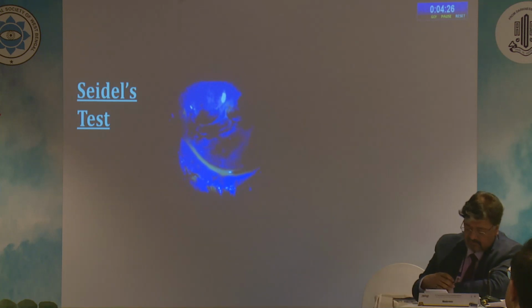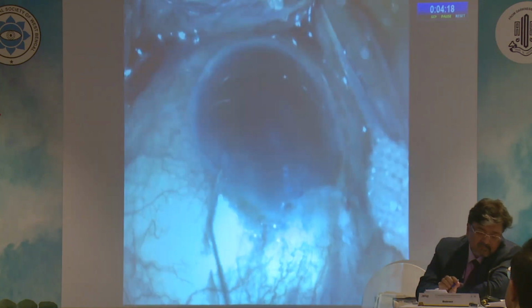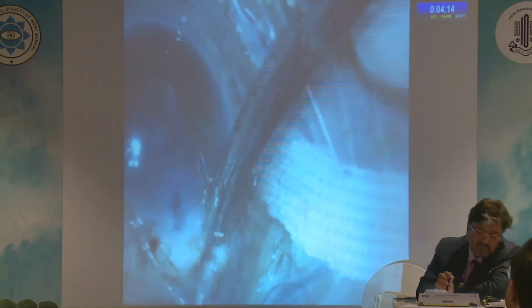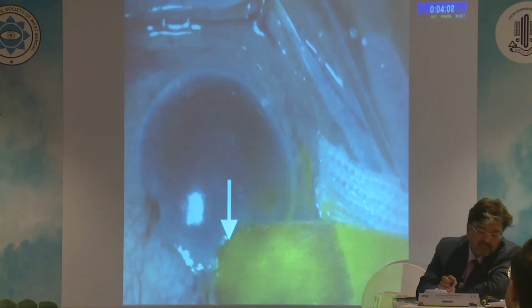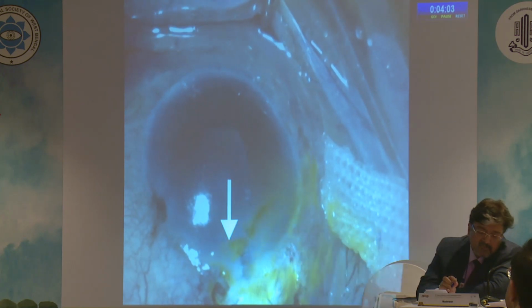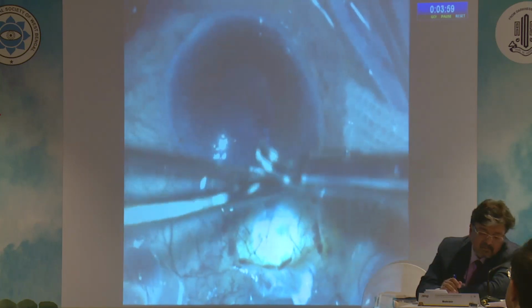Large diameter bandage contact lens and cycloplegics were tried, following which wound exploration with or without a scleral patch graft was planned. Subtenon's block given, AC formed through the side port, conjunctiva was gently reopened and Seidel's was performed. Active leak was found at the site of corneal traction suture during primary surgery. A 10-0 nylon suture was placed.